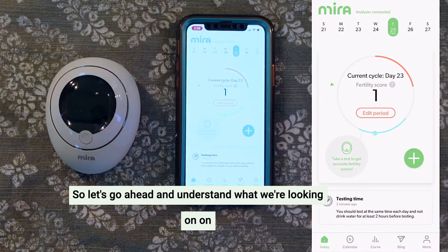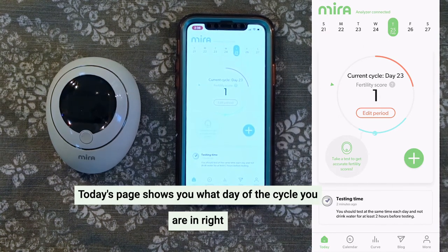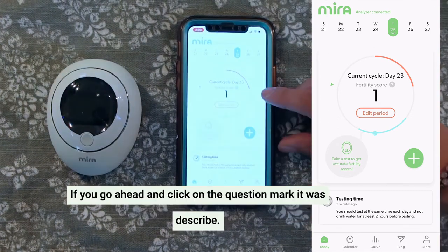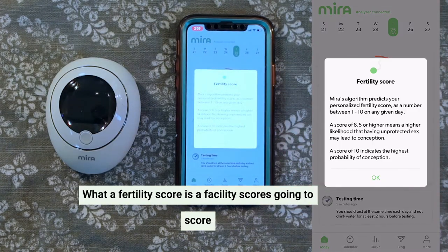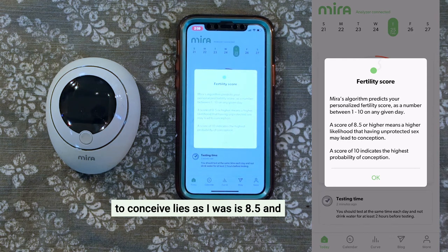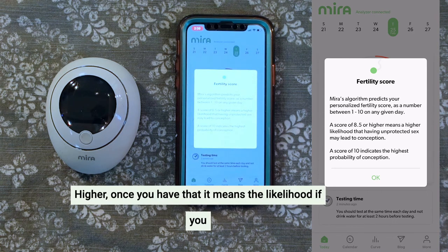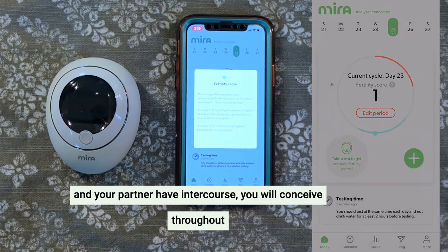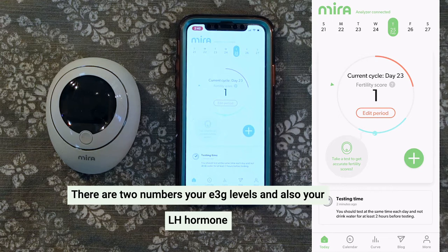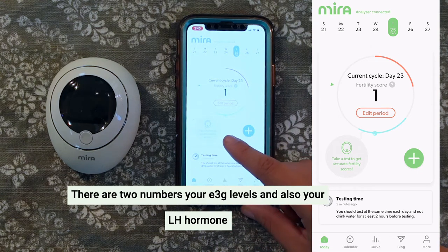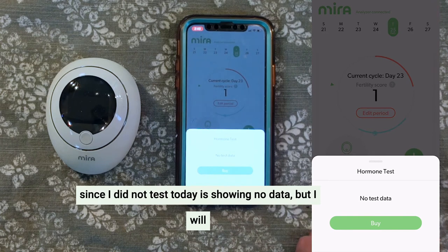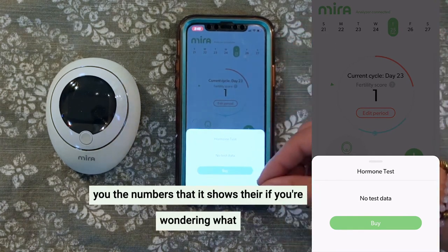Let's go ahead and understand what we're looking at on the today page. Today's page shows you what day of the cycle you are in right now. The red one indicates your period; the blue one on the bottom shows your fertile days. If you click on the question mark, it will describe what a fertility score is. A fertility score is going to score you 1 to 10 on any given day. Your goal, if you're trying to conceive as I was, is 8.5 and higher. Once you have that, it means the likelihood that if you and your partner have intercourse, you will conceive throughout those days. If you do a test that day, the app will show you your hormone numbers on the first screen. There are two numbers: your E3G levels and also your LH hormone levels. Since I did not test today, it's showing no data, but I will go ahead and test later and show you the numbers.